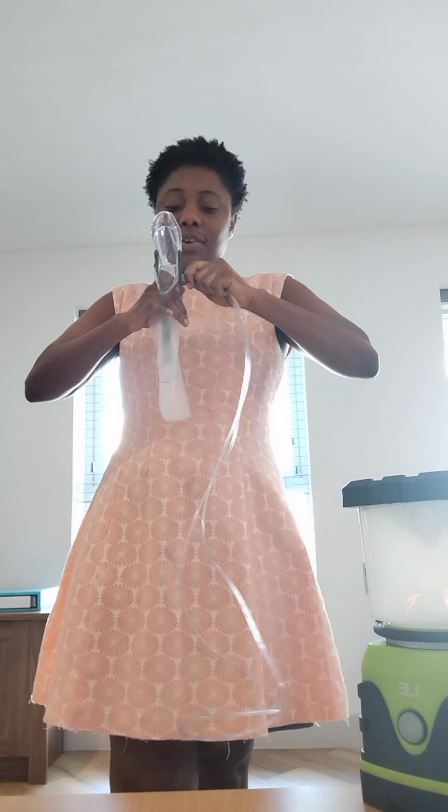So the tubing has two ends. One will be for the flow meter, and one you attach to the reservoir mask. So I'm going to assemble and attach one of the tubings to the reservoir mask and connect this to the flow meter, okay? So I'm going to adjust the flow meter to 15 liters per minute so that the ball will be in the middle of the line.